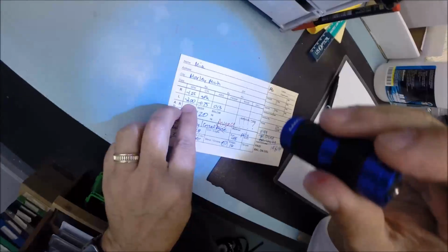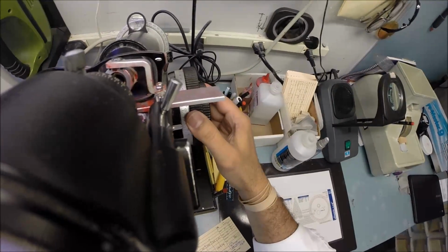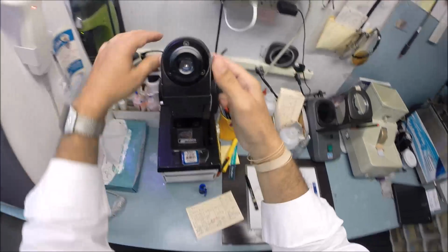-2. Where did I see -2? There it is. You have another -75, 3 steps of astigmatism correction. What happens if you loan someone $2 and then they borrowed another 75 cents? They would owe you $2.75, 1 tick mark away from 3, so that is perfect.